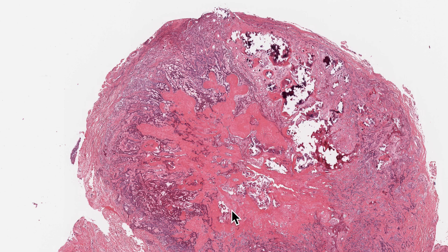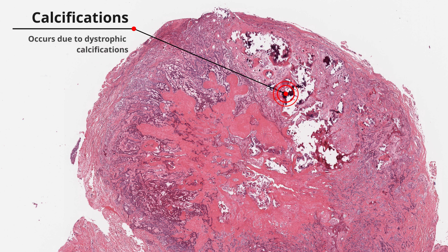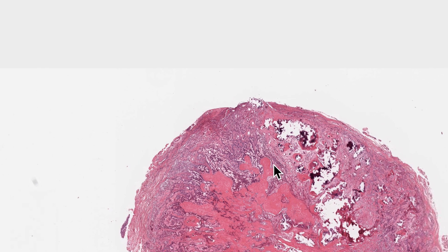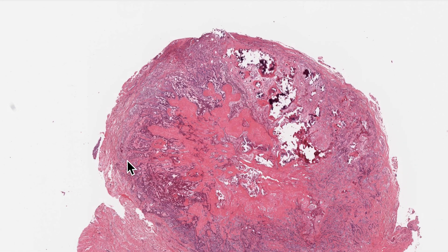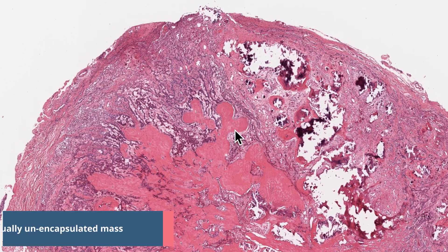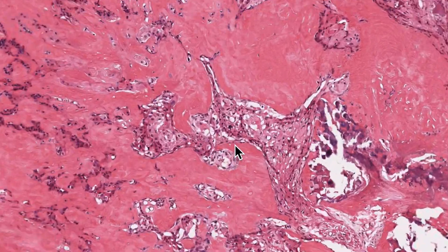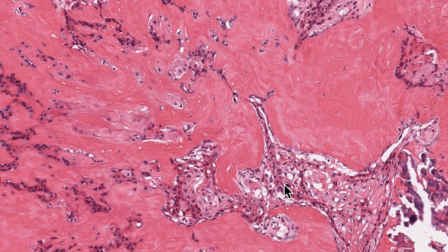This is the lower power view of calcifying epithelial odontogenic tumor. As we can clearly see at this magnification, there are areas of dystrophic calcifications — that is the reason why we see radio-opacities within the radiolucency when we take a panoramic radiograph. One more feature to notice: this mass is not encapsulated. CEOTs are usually unencapsulated and locally infiltrative.